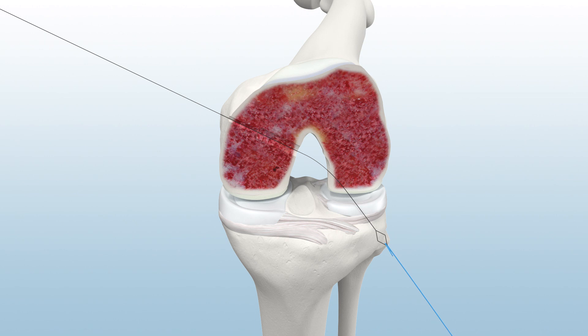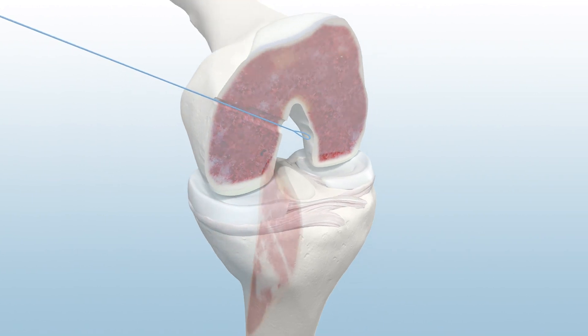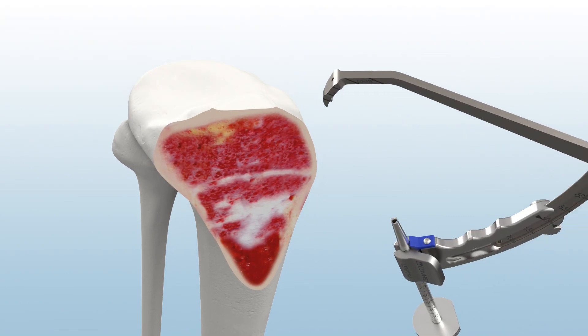Then, load a passing suture. For tibial reaming, assemble the Infinity Modular Guide System using the tibial PCL guide arm and the 2.4 mm guide sleeve.